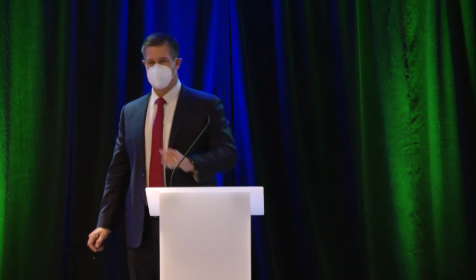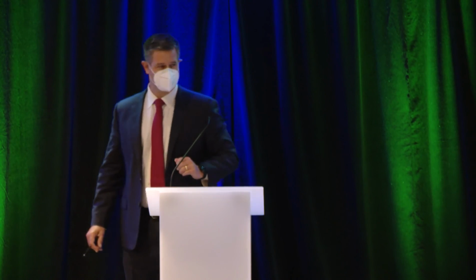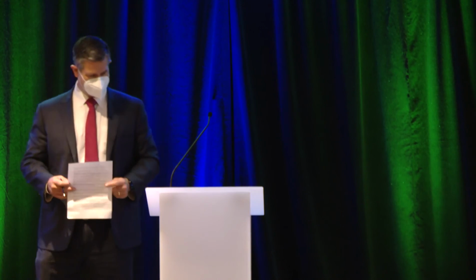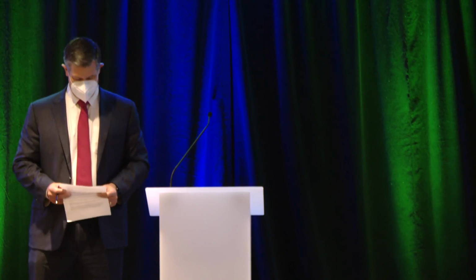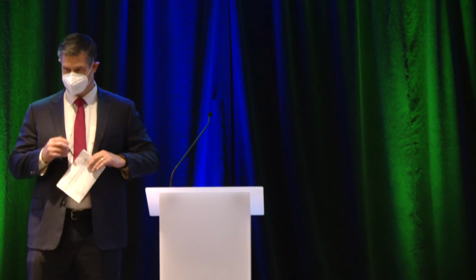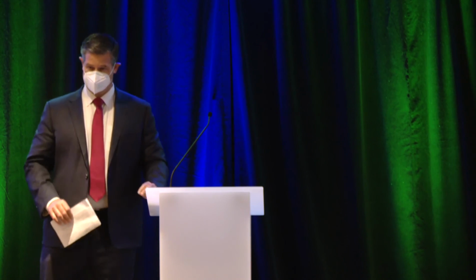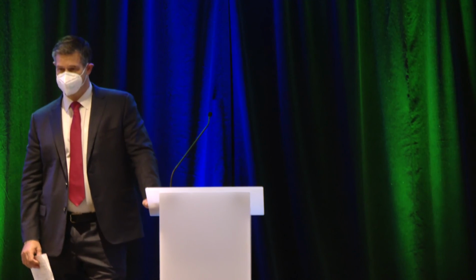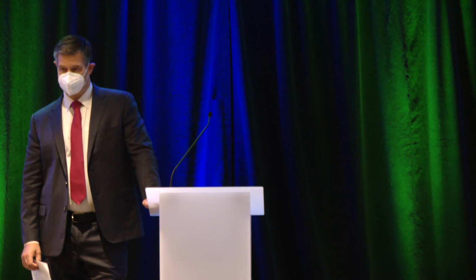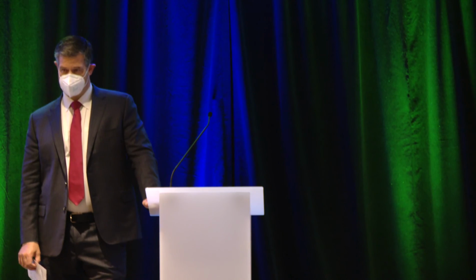All right, we have a question. If you all don't mind coming up to the microphones, that would be great. Good morning. Thank you so much. Really informative. Just a quick background: I work in a small hospital, so I function as a GI and as a surgeon. My impression of Chicago classification 4.0 is that some of it is kind of backward, where you do the manometry and then you do the EndoFLIP. In my practice, I do HD, Bravo, EndoFLIP, and then when I encounter an abnormality, then I get the manometry. So what are your thoughts about that?